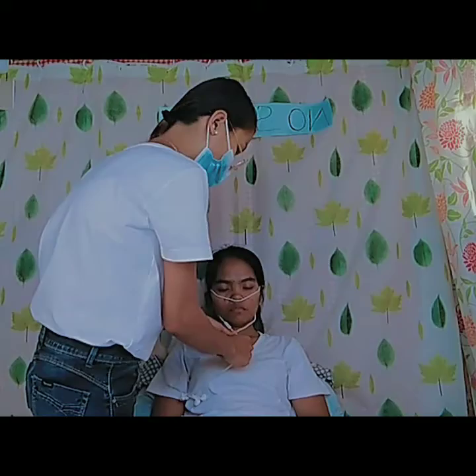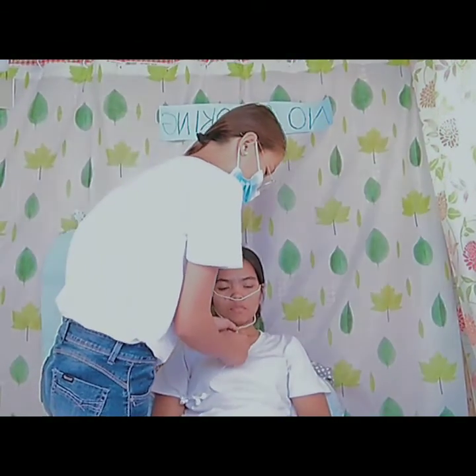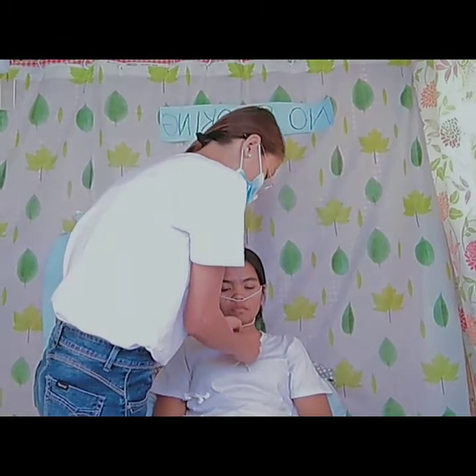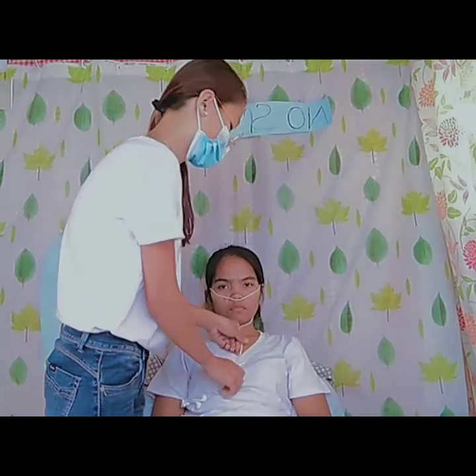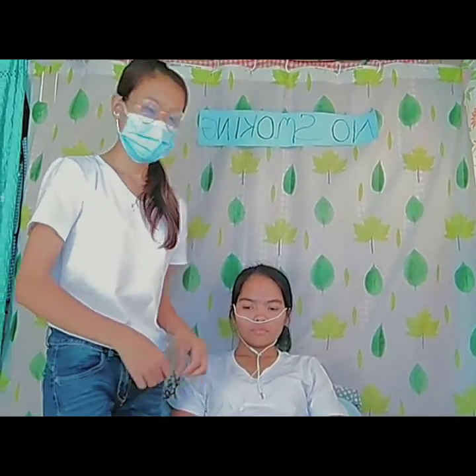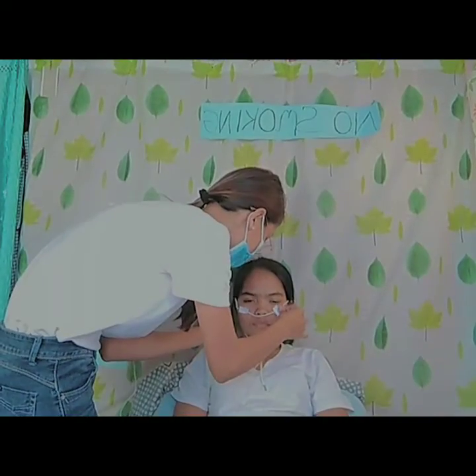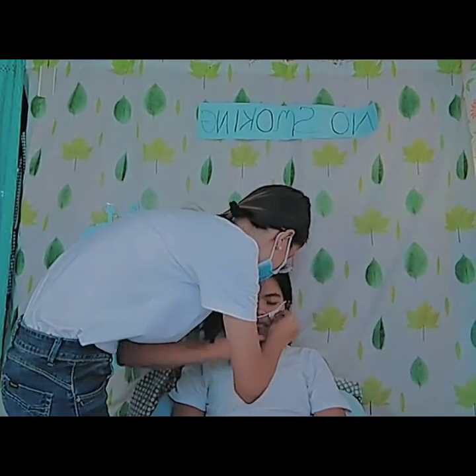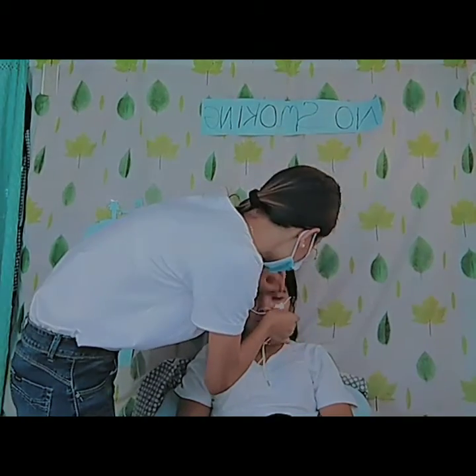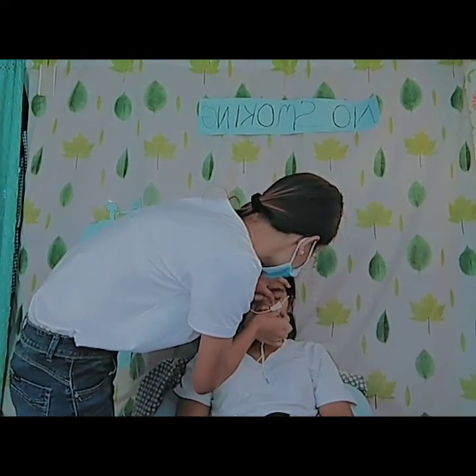Then we're going to adjust the plastic slide under the chin until the cannula fits snugly to the patient. Then add tape as necessary. Okay, so we're done now using the nasal cannula.